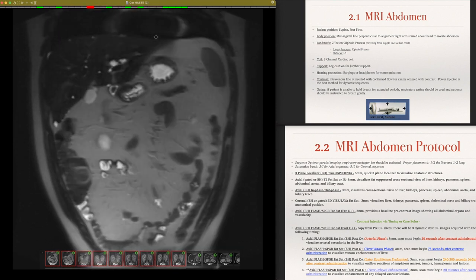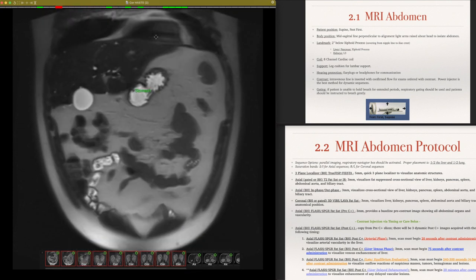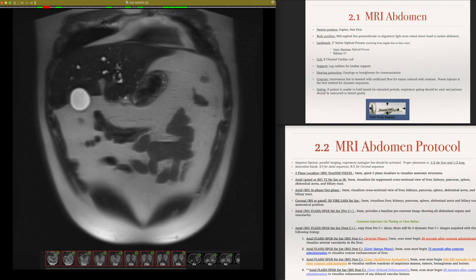I did label a couple of these organs that I really wanted to take a look at. So we'll start here. The gallbladder is going to be found just inferior to the liver.